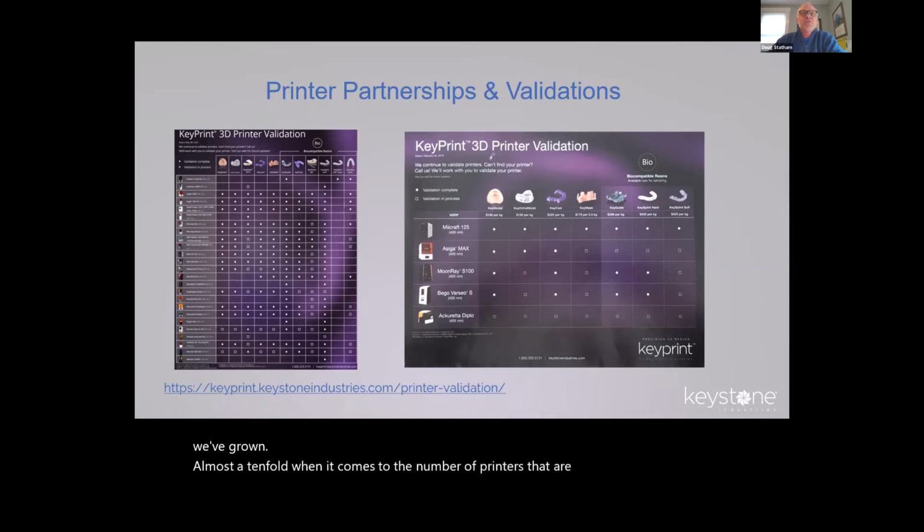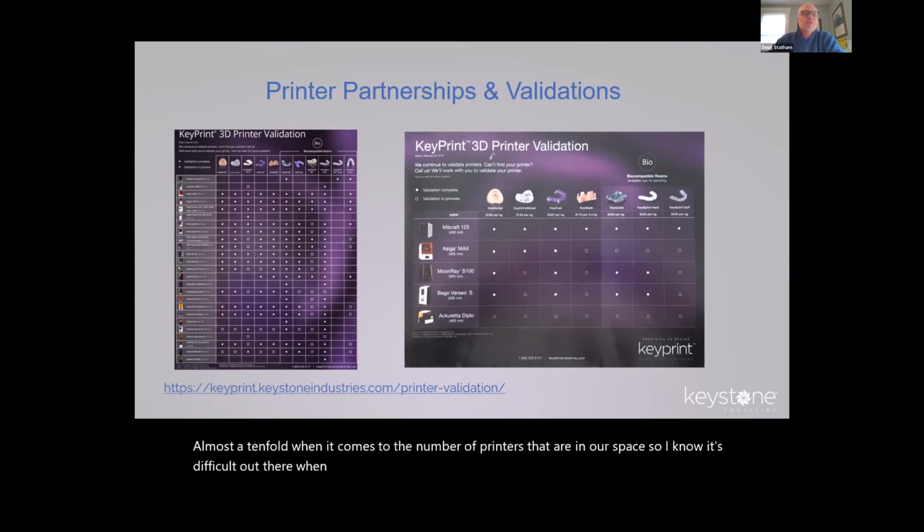I know it's difficult out there when you're shopping for printers and deciding which ones to go with. This is a great resource for you to go to and really take a good look at which printers are truly open, because if they're not open, you're going to be limited on the materials that you're able to use in it.